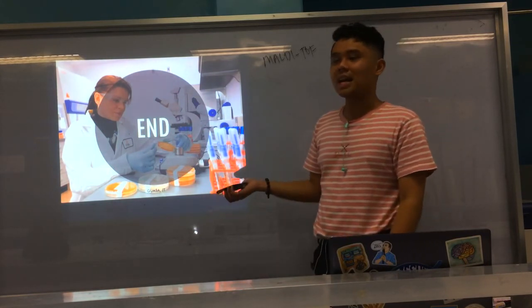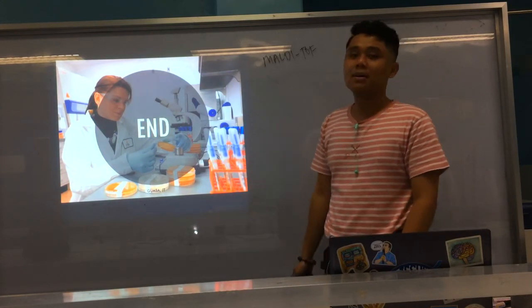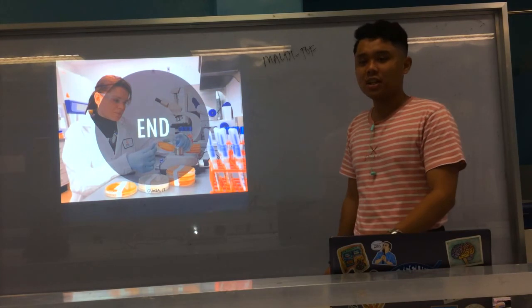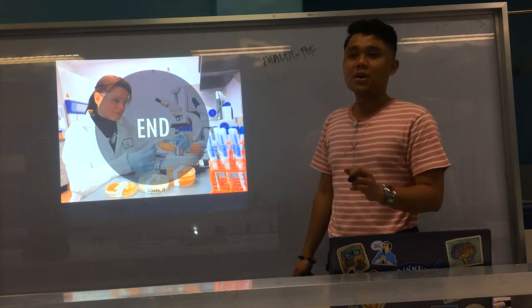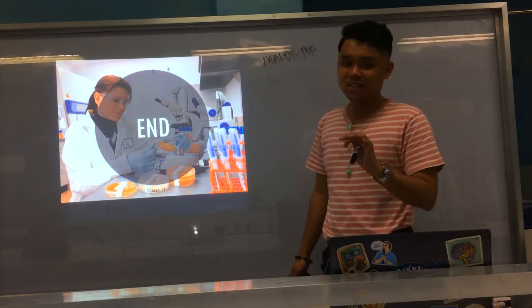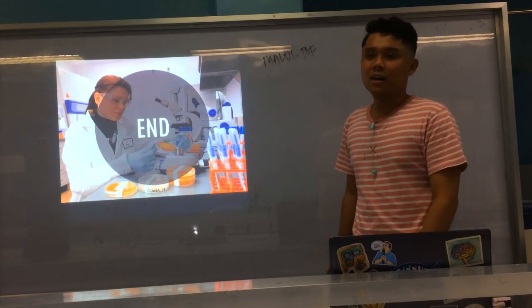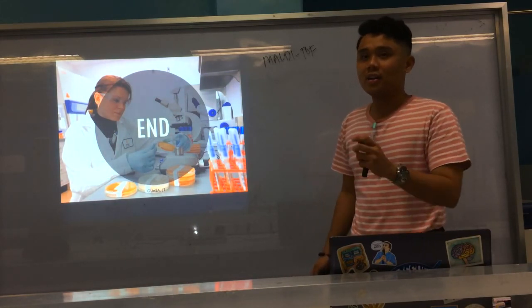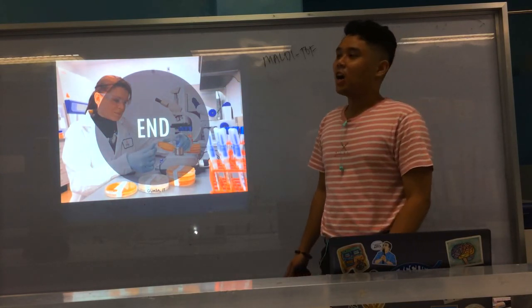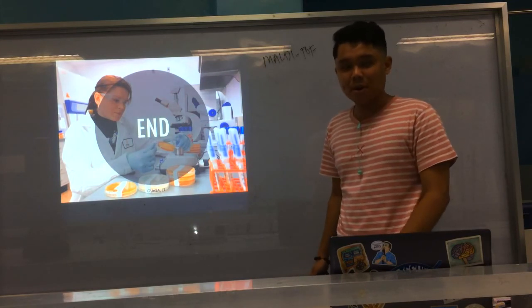Okay, but again, in routine clinical labs in hospitals, usually we still perform biochemical testing, because if you only opt for the species and not yet the subspecies, the biochemical tests can provide that. But again, as I mentioned, there are limitations. That is why this is where the advanced tests, the molecular methods, come in. Alright, but for now, that's for gram-positive cocci biochemical testing.